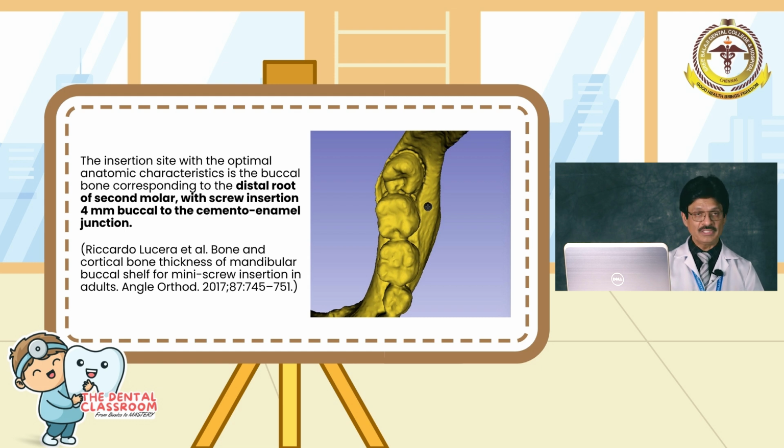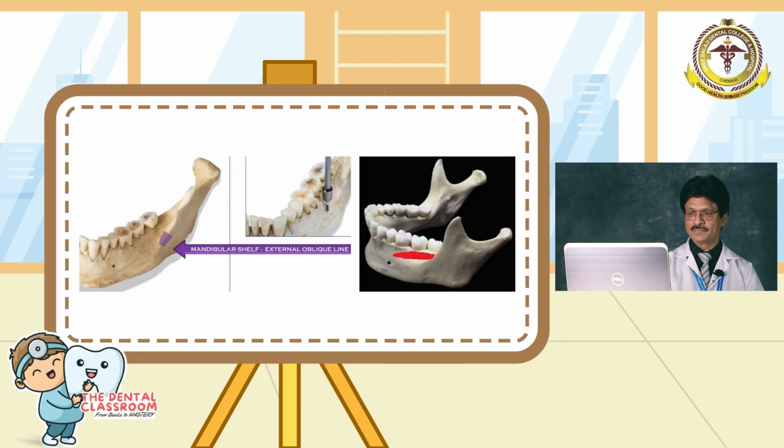This is a good cue as to where to place the MBS screw. So you can see the external oblique line, you can see the mandibular molars, and then you can see the red colored portion. That's the area where you can place the MBS, but more so buccal to the distal root of the mandibular second molar.